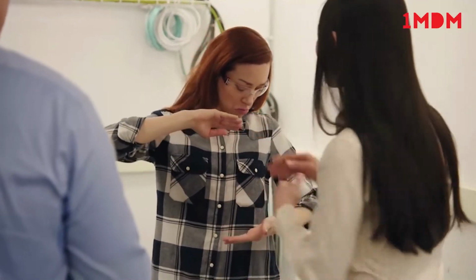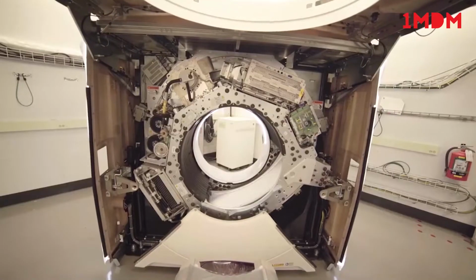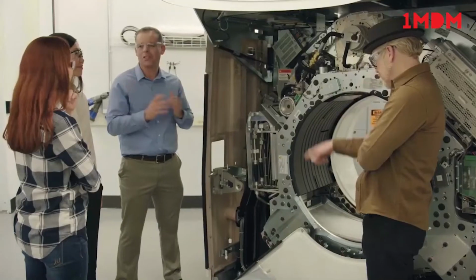So let me understand this. Previous CT scans would scan what, like 4 centimeters? Is that like this much of the heart? Yeah. And then what does this do? So now we've expanded it so you're covering the whole heart in one rotation. How fast does this spin when it's operating? So it rotates around 4 times a second. It's incredible. It's around 2,800 pounds, the size of a small car. You're trying to take 1,000 images in one rotation, and those images come out perfectly. The feat of engineering is just phenomenal when you consider that.